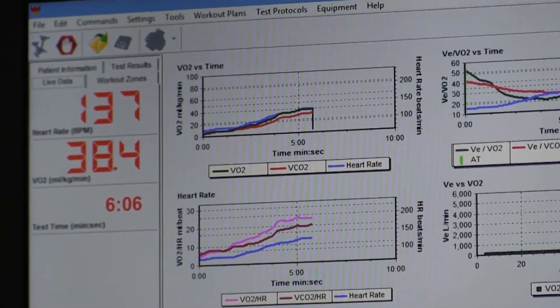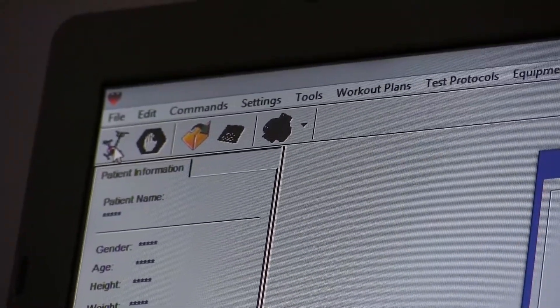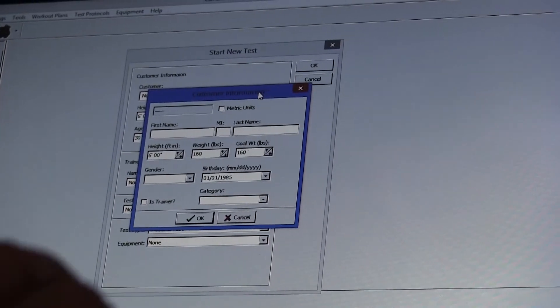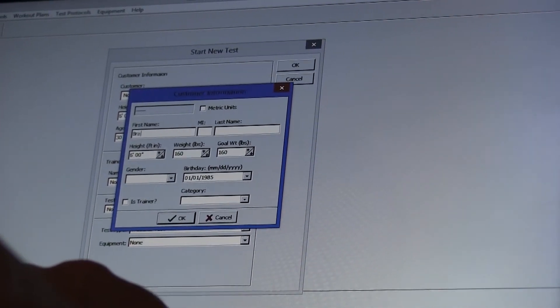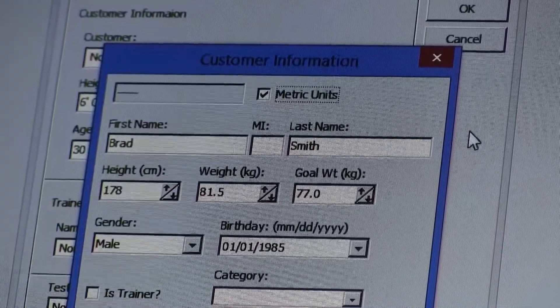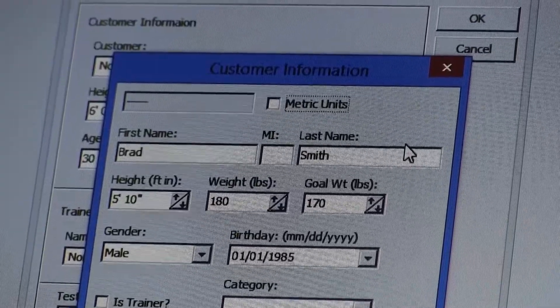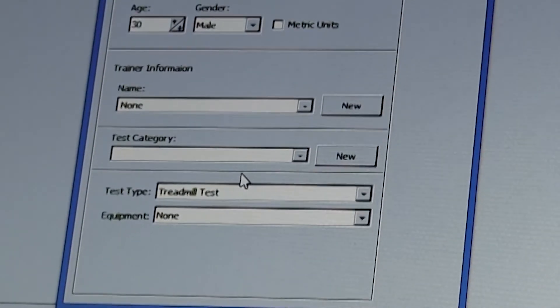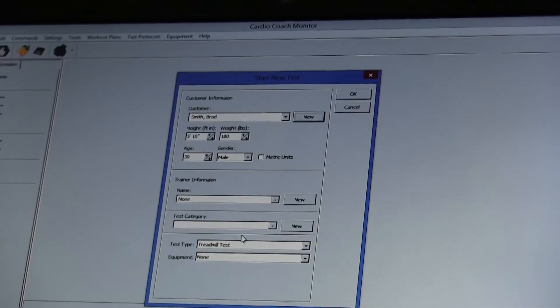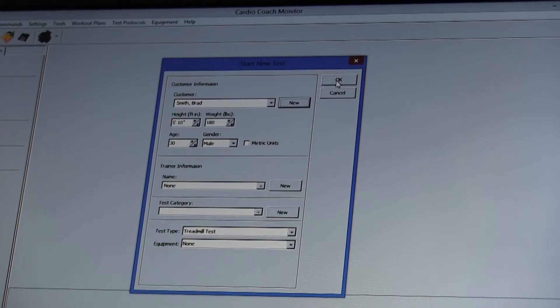You can start a new test on the software by clicking the bike icon in the top left corner of the window. Enter in the requested information including name, age, height, weight, and gender of the test subject. Note that there are toggles next to some of the values in order to change their units. Select the test type and enter a trainer name in the space provided if necessary. When you are finished entering all necessary information, click the OK button.